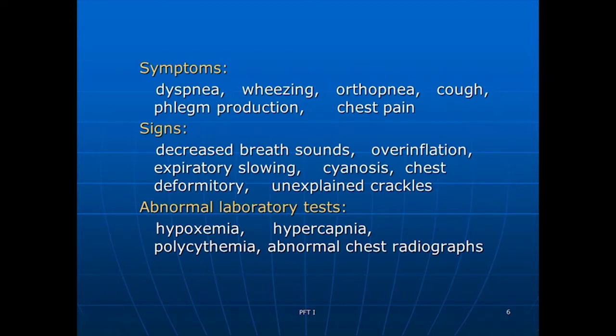Patients often come in with wheezing. Again, wheezing can be an early sign of asthma, so often the physician will order a pulmonary function test to determine the extent of the wheezing and where this wheezing is coming from. Is it due to some kind of intrinsic asthma, or can it be other types of obstructive diseases that are making this patient wheeze?